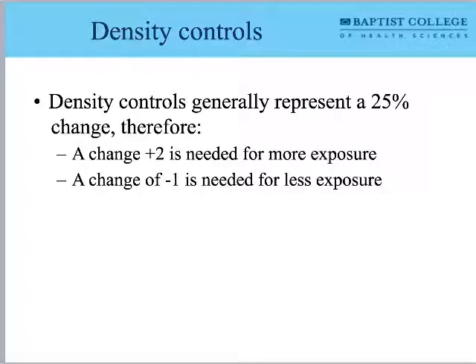But oftentimes, what the registry exams and things like that are more interested in, again, is just the critical thinking part to this. Like, what might be required for a patient, right, who I do the exposure, I see what I need to do, here's a list of technical factors, I need to change something with the density controls, right? So it's generally given to you as a patient care situation, right? And you don't need to know, oh my goodness, did I do it 2 up or 1 down? That's just more for techs, something to keep under your hat as you're doing the work.